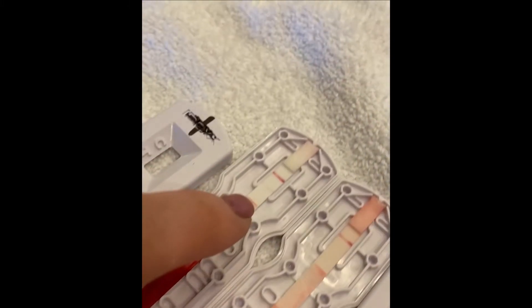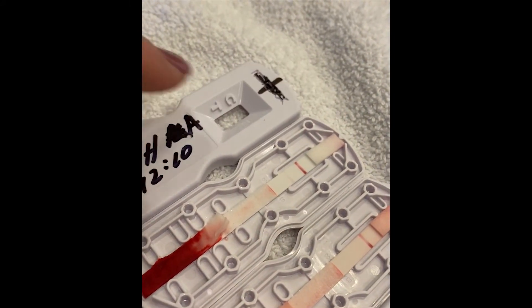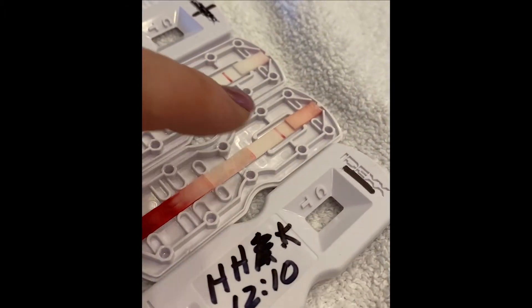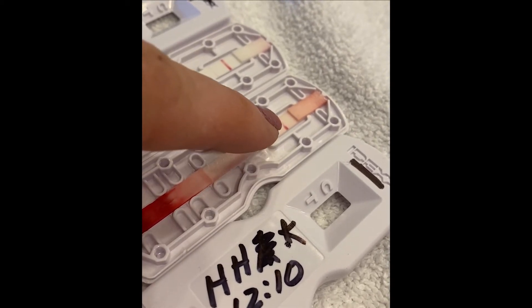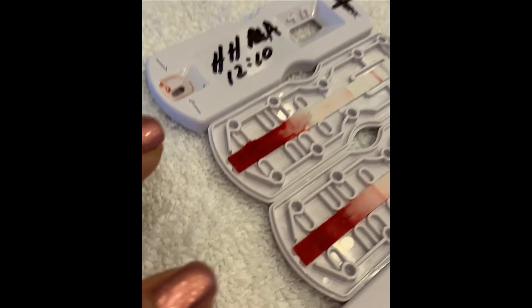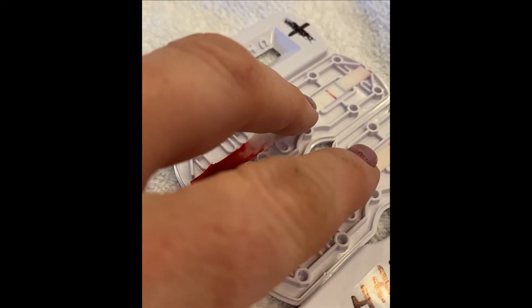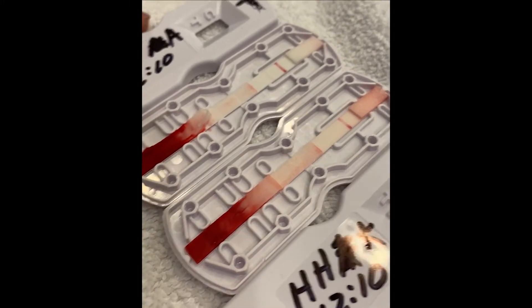You can see a very faint line right there — that's a positive test indicator right there where the test window is. And that's a control line, which means the test worked properly. There is not a line here for the test; that is a control line. And then these are just absorbent pads to keep the liquid flowing and continue to draw it across so that the indicator chemicals can flow all the way up the test and hit the test window.